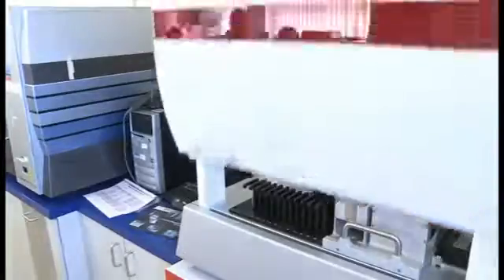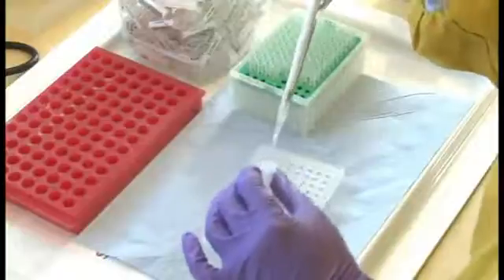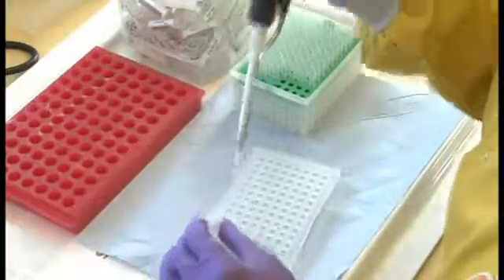But before we can detect that material we have to actually get at it. And we do that by extracting nucleic acid from the virus. The virus actually resides in the cells, so we have to break open the cells to get at the nucleic acid.